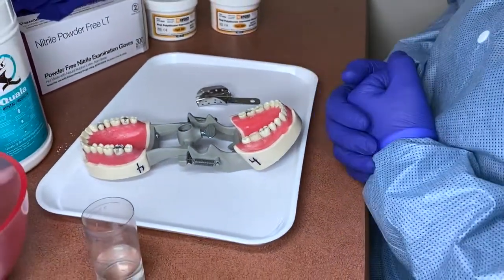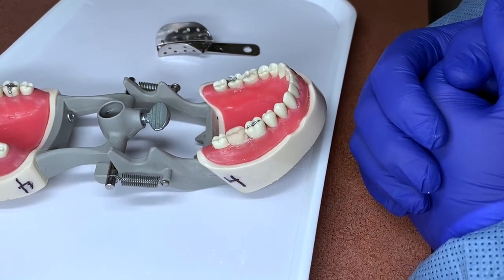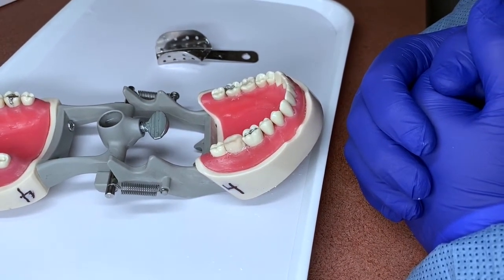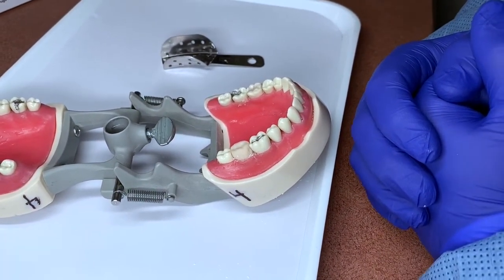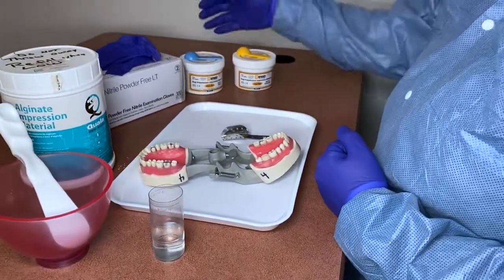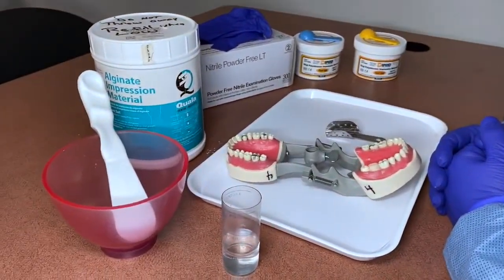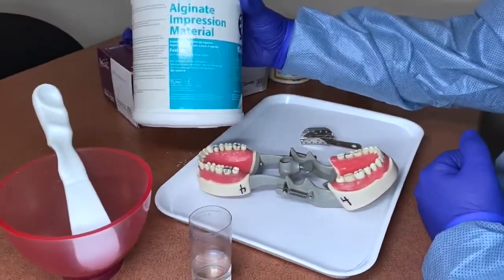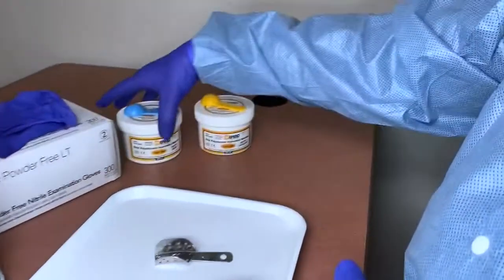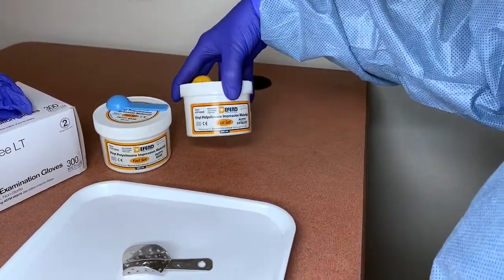For teaching purposes, this number 31 already has a temporary on it, but we're going to act like it's an unprepped tooth. There are two different types of impressions you can take: you can either take an impression with alginate or with VPS putty, and there are many different brands of putty you can use.